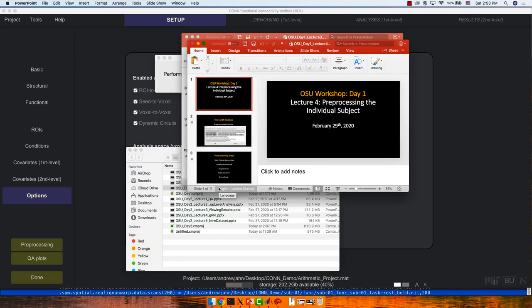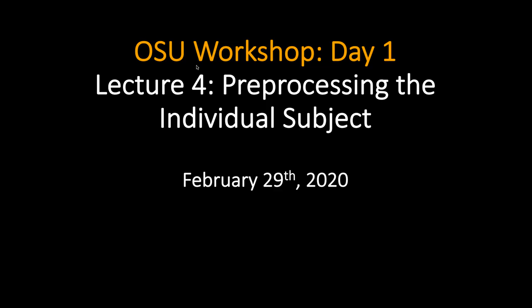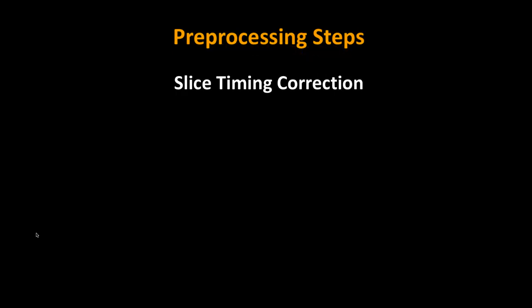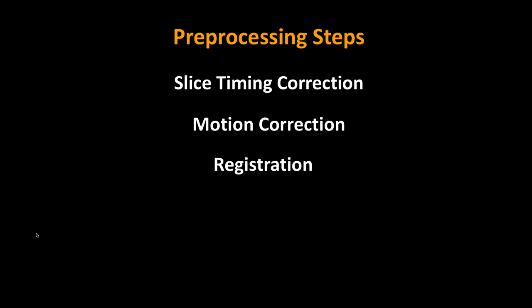While the preprocessing is running, let's ask: what exactly is it doing and why? The default preprocessing pipeline works in virtually all cases — you really need to know what you're doing to select something aside from that. The major steps are: slice timing correction, motion correction, registration, normalization, and smoothing.